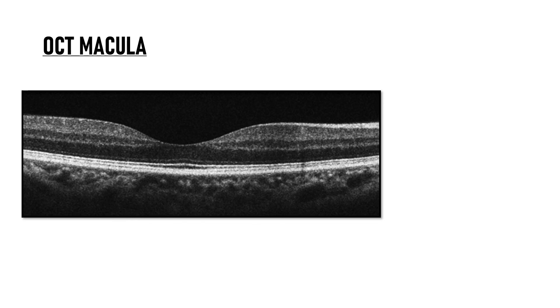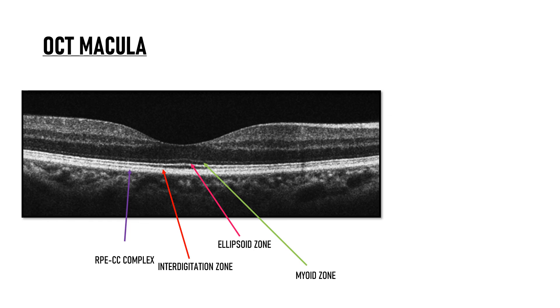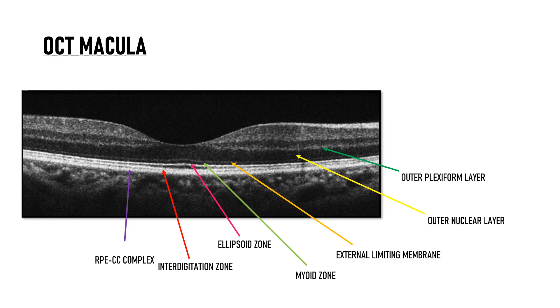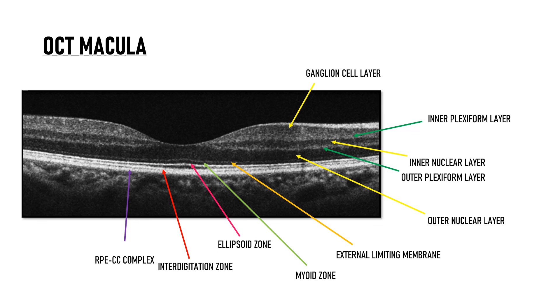Let's revise the layers of retina on OCT once again. The hyper-reflective band at the base is the RPE-CC complex, then the interdigitation zone, then the ellipsoid zone, then the dark myoid zone, then the hyper-reflective external limiting membrane, then the outer nuclear layer, then the outer plexiform layer. The next layer is hypo-reflective — the inner nuclear layer — followed by the hyper-reflective inner plexiform layer, then the ganglion cell layer, then the retinal nerve fiber layer, and finally the innermost layer, the internal limiting membrane, which is hyper-reflective.